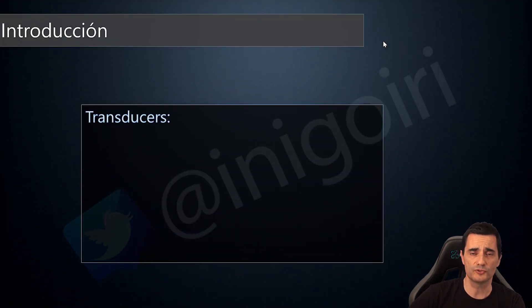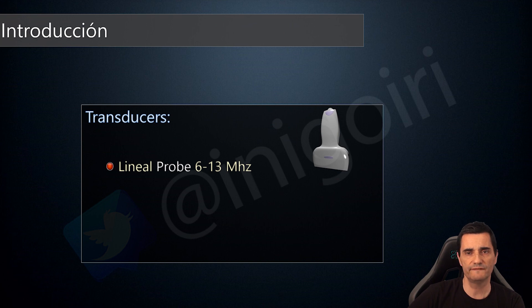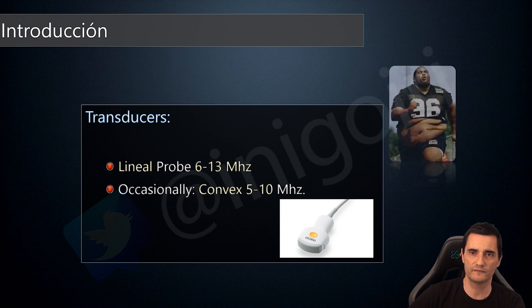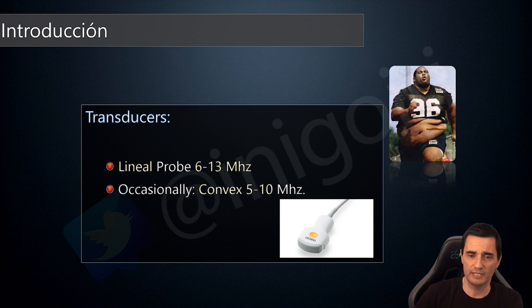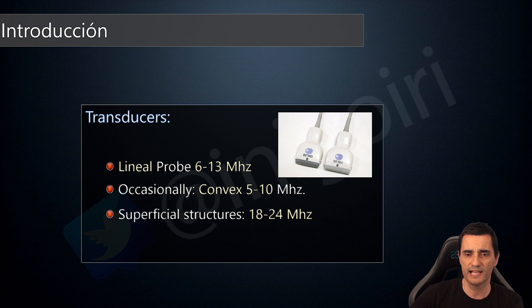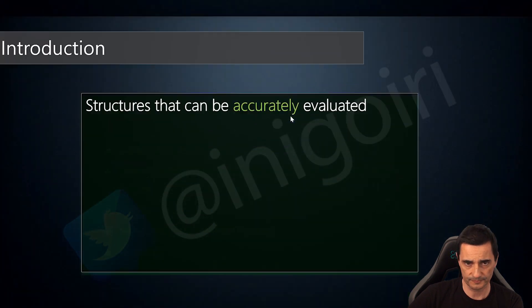Which transducers will we use on the knee? Mainly the linear probe with 6 to 15 megahertz — between 6 and 15 megahertz will cover almost all the pathologies of the knee. Sometimes we can use convex probes with 5 to 10 megahertz or microconvex probes in some particular patients, but this is not frequent. Very high frequency probes of 18 megahertz may be used for bursitis or nerve evaluation, but not very commonly.